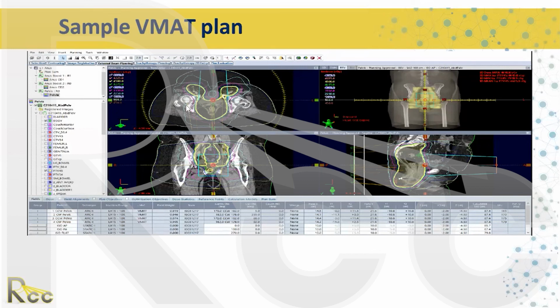So they get a small amount of radiation. This is good for the patients because they get fewer side effects. We are able to give a higher dose to the cancer area, and the rest of the critical structures are getting less radiation. So because of the way the MLCs are constantly moving, you can't see the light field.